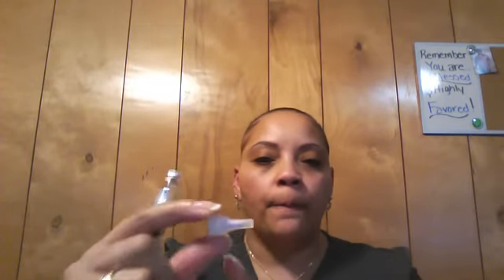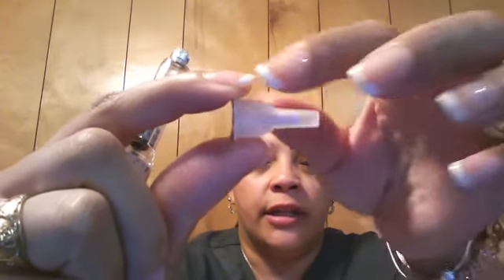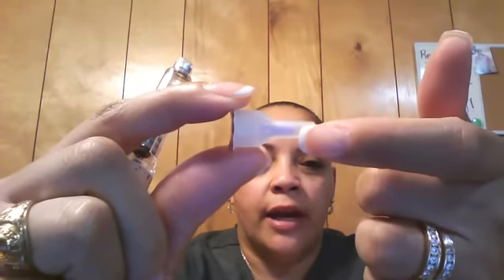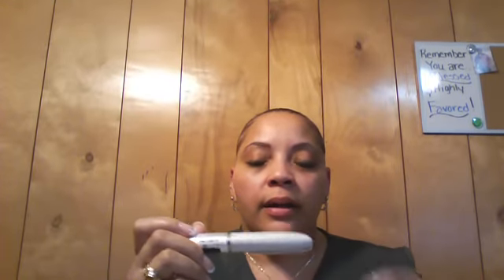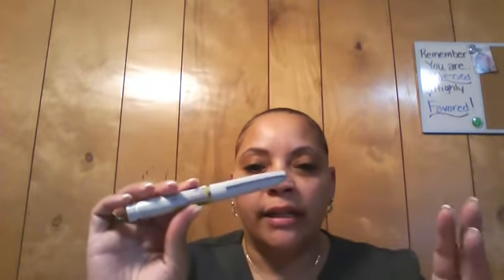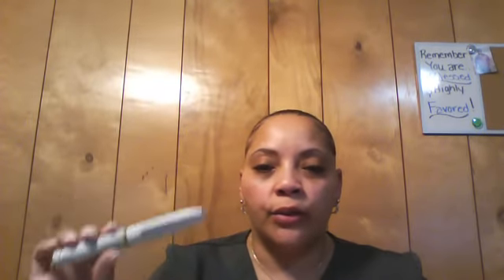This needle has a purple tip, a needle protection, and then this is the protective cap. So I will not recap the needle, but I can put this protective coating back over top of the needle, unscrew it from the pre-filled syringe, and dispose of this into the appropriate disposable recyclable, which is the Sharps container. I will clean this off again, re-put it in, recap this, and I will take this back to the patient's Pyxis.